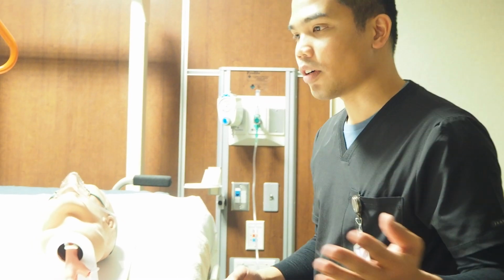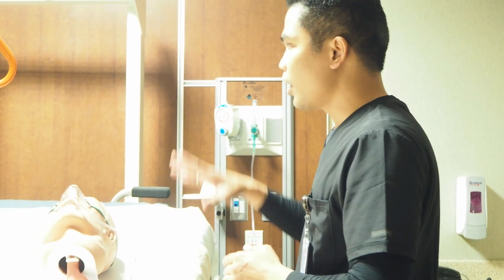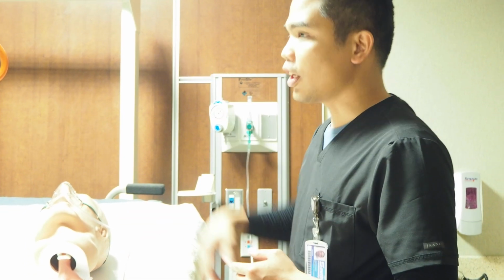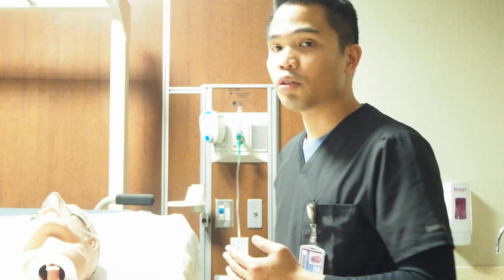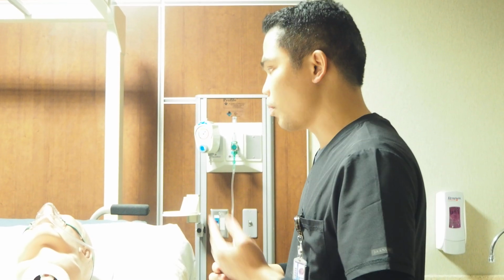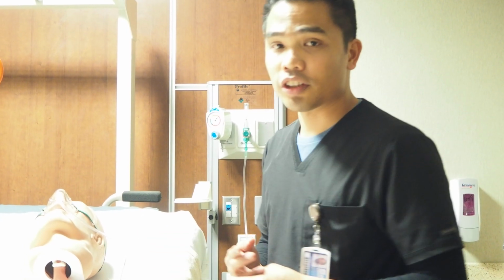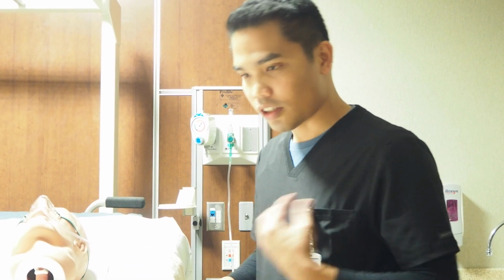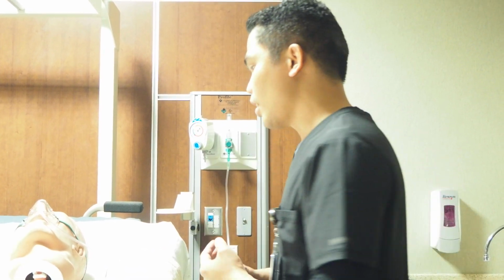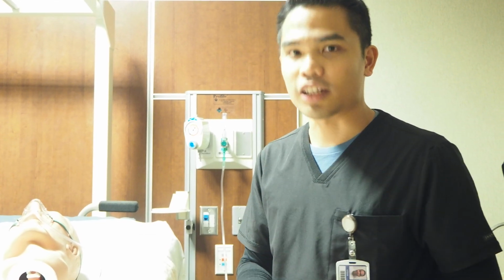After that we can observe the patient and then reassess, and in a few minutes, well, I'm back right now. A few minutes after I hooked up the simple mask, I've noticed the SpO2 of the patient rises, about 92 to 93 compared to the previous one, and the patient is a little bit more conscious. When I observe the auscultation, the congestion was almost totally gone.